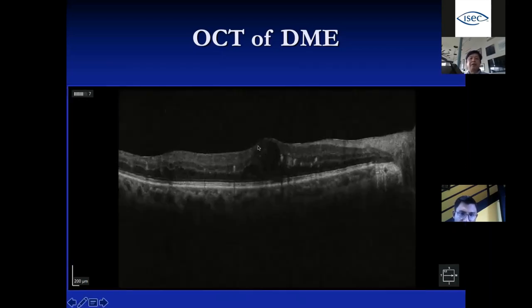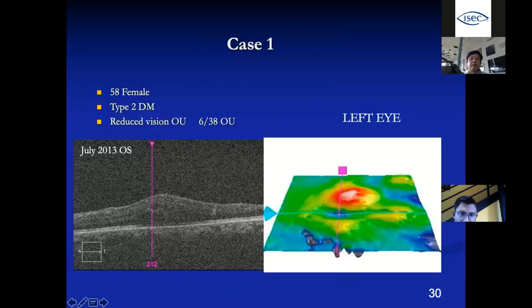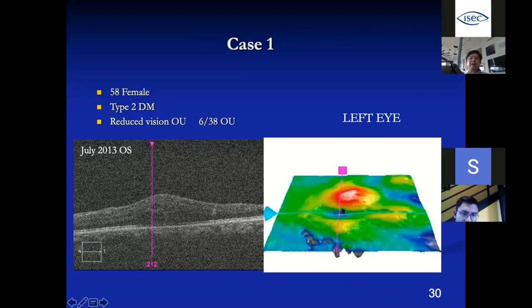Another patient shows a large cyst in the center of the fovea, but still good integrity in the photoreceptor layer — so by treating this, we can reverse poor vision. OCT can also give you a thickness map to guide you: the pit is the fovea, and depending on where you cut through, you can see the foveal swelling. This 3D map shows the location and extent of the edema.